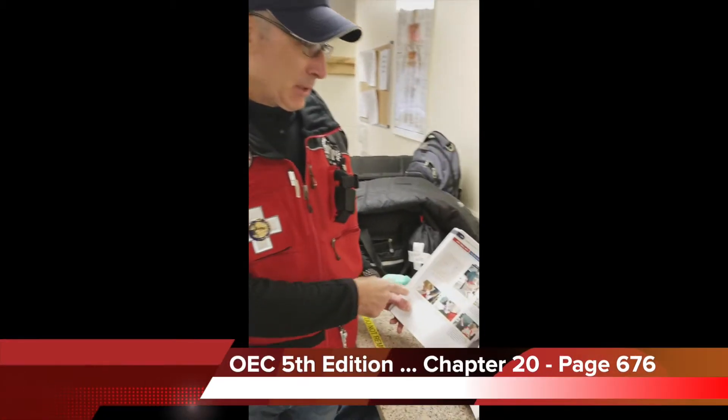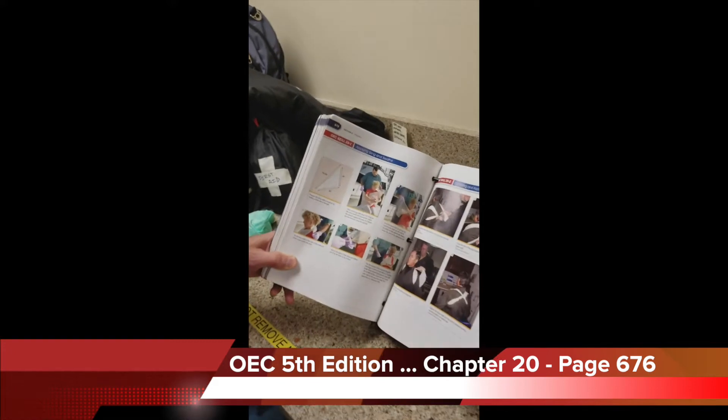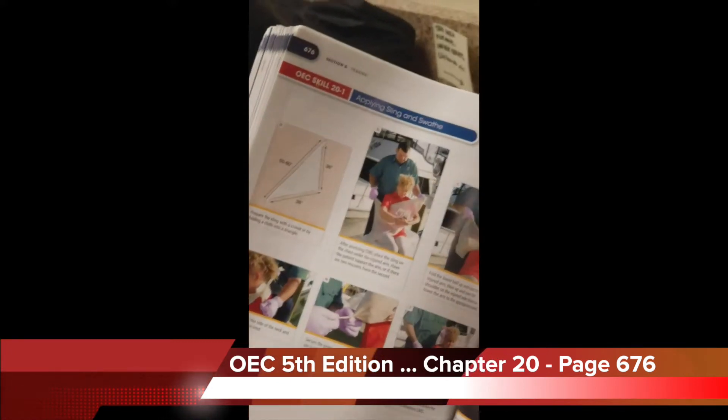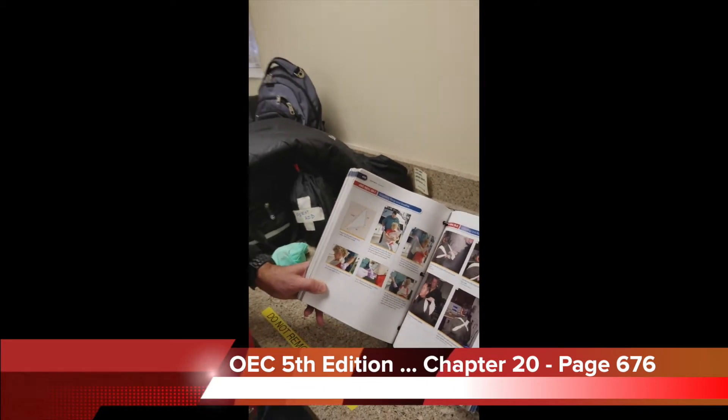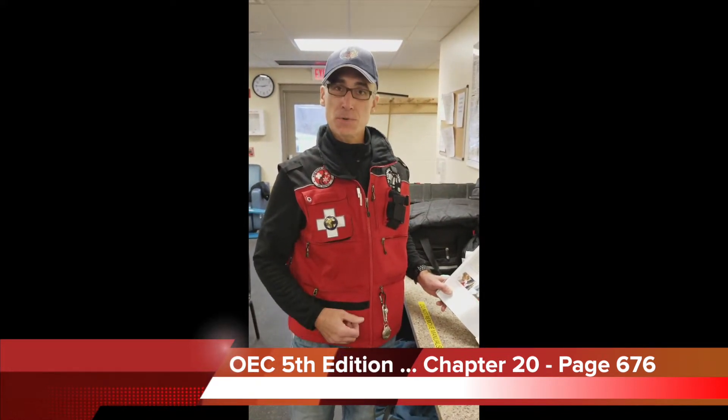Hi, this is Kelly Clem with Mad River Mountain Ski Patrol. Today we're going to demonstrate the application of a sling and swathe as shown in the OEC manual chapter 20, page 676. We use this for the immobilization of the upper extremity for injuries such as clavicle fractures, upper arm fractures, or strains or sprains.